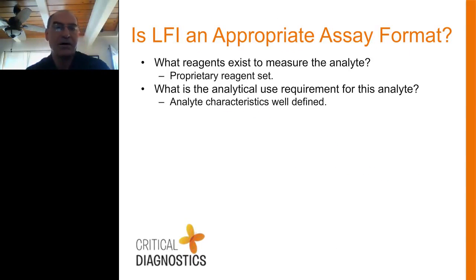Now, some of the areas, and I touched on this previously, was moving forward. So we established the ELISA as our first method. That's now being used around the world. Moving forward, we needed a more appropriate test for rapid turnaround time. Even though ST2 is a prognostic test, so short turnaround time is not an absolute requirement, many laboratories don't like to do ELISA, so a test that's more appropriate to every hospital, that provides a more reasonable 1 hour turnaround time, was important.